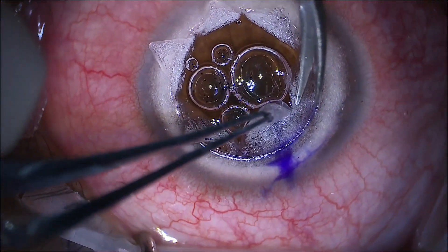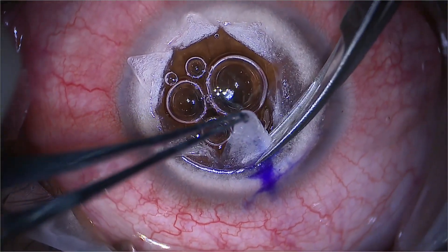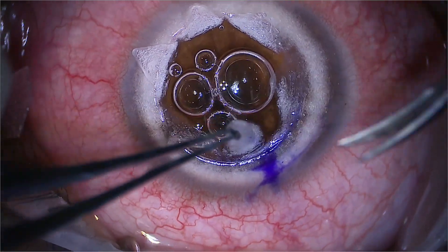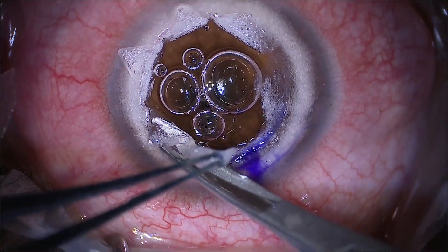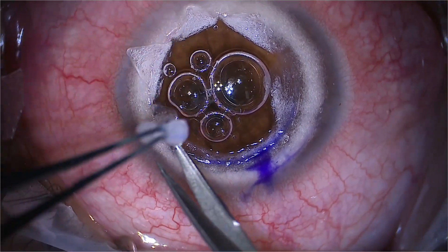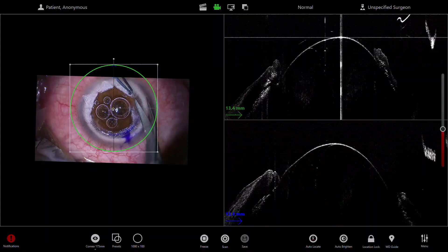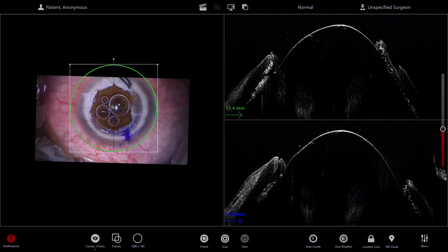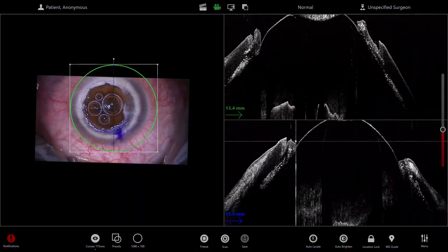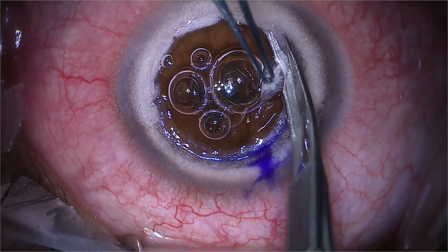This is coming along very nicely, and you can see the really clear Descemet's membrane underneath, with bubbles still within the anterior chamber. I'm carefully removing the segments with the DALK scissors — you can see the shape of the scissors is much better now. Here I'm very carefully removing stroma up to the edge of the trepanation point and not beyond. Here you can see with the OCT, which is again very useful, the Descemet's membrane appearing as a white line — this is really useful to see, especially when judging if there's any residual stroma with a manual dissection.